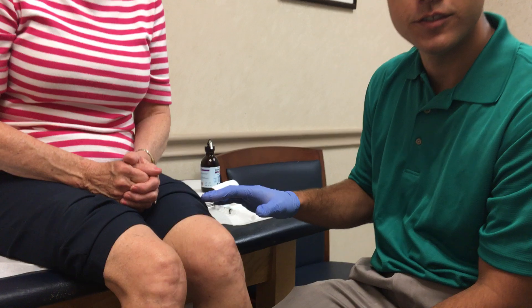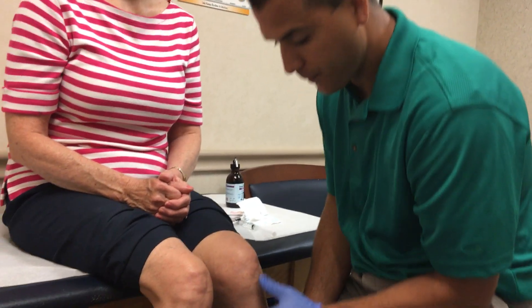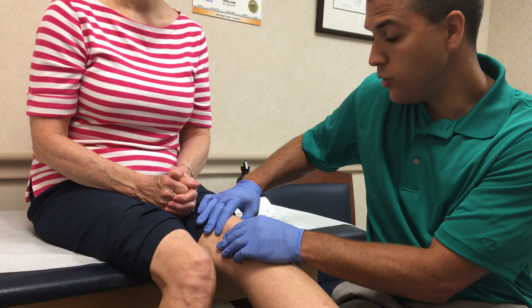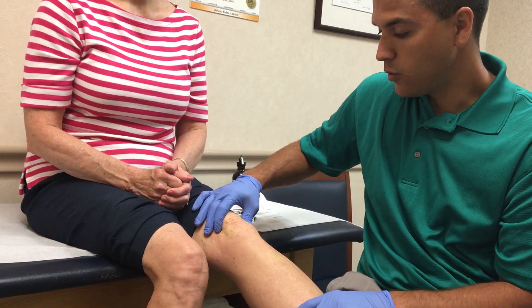So as you can see, I have the patient's knee flexed at 90 degrees on the side of the table. And the first thing I do is go ahead and see if the patient has a joint effusion as I extend the knee. So no joint effusion.